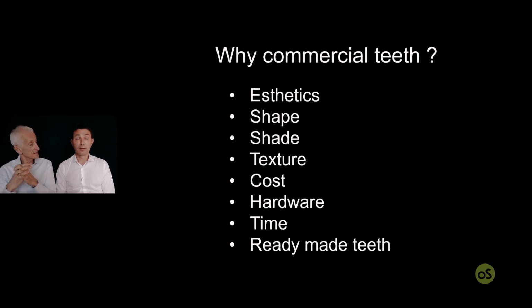Is this correct? Yes, because the commercial teeth, especially in the anterior region, are very particular because they have 5 layers of different color in every kind of tooth, and the shape and the texture are very, very natural.